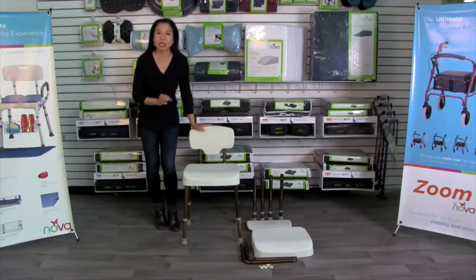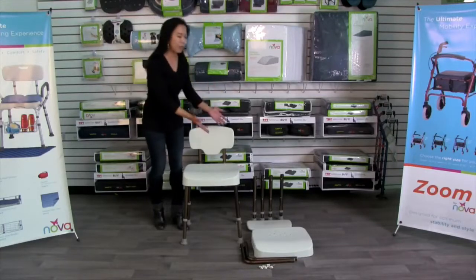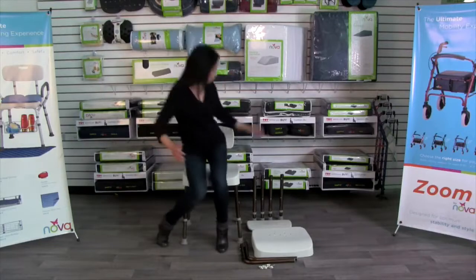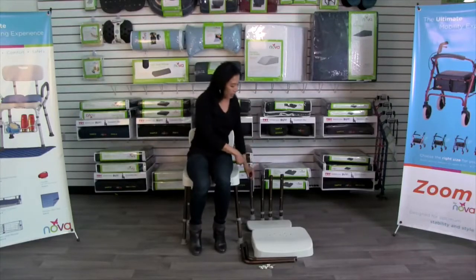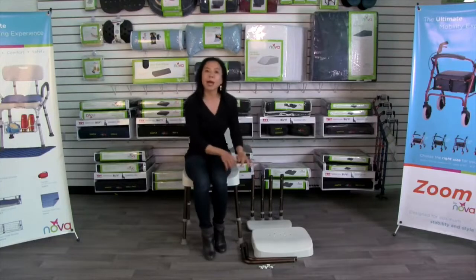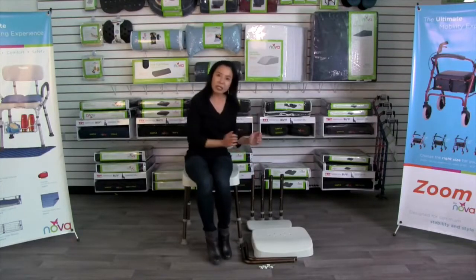This bath chair is so easy to assemble — it just takes a few minutes and there's no tools required. When you get the product and take it out of the box, you will find four legs with wide tips and drainage holes, plus the seat and the back.